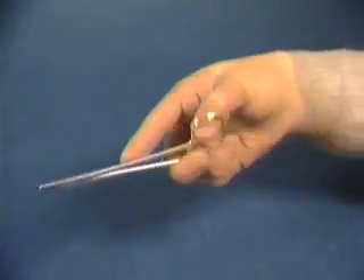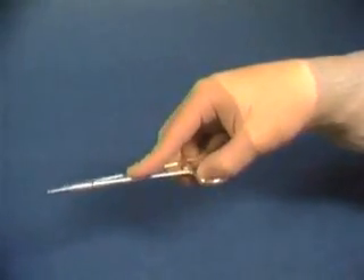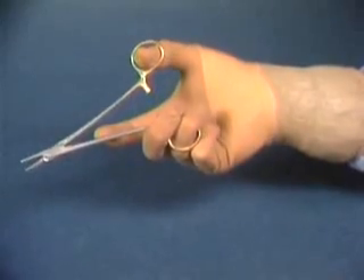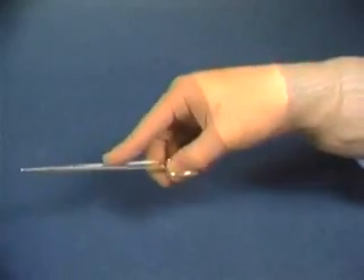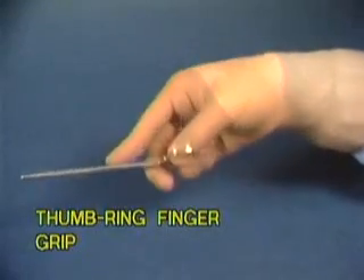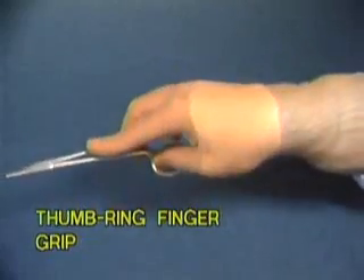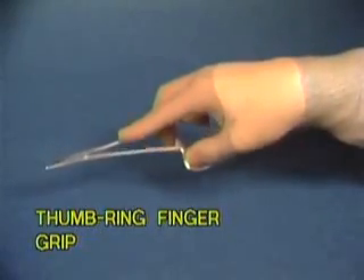Each needle holder grip has specific mechanical advantages and disadvantages which dictate its use in a given surgical situation. For the most part, and in most small animal surgery situations, you will use the thumb and ring finger grip. This grip's best asset is that it allows precision in releasing the needle, since the thumb actually releases the lock on the instrument.